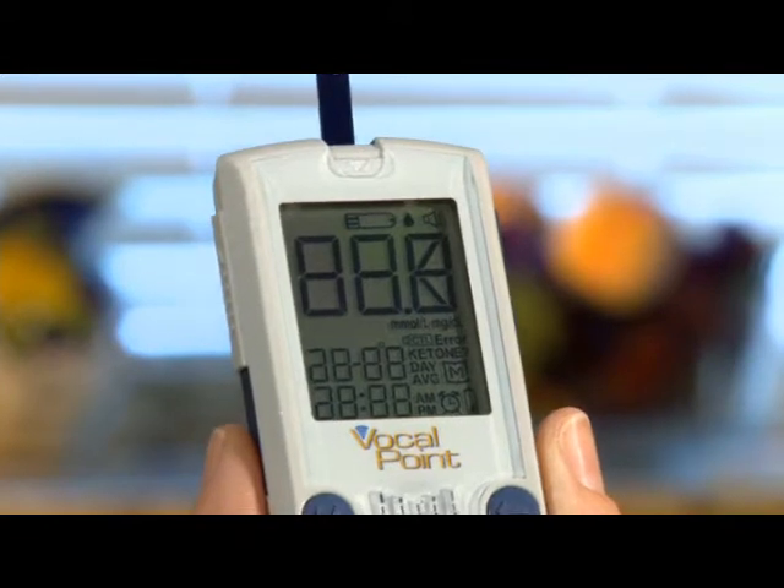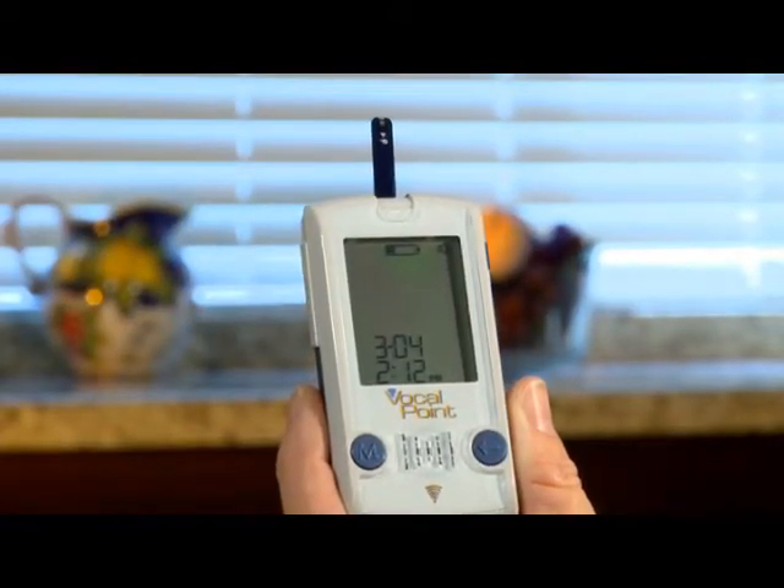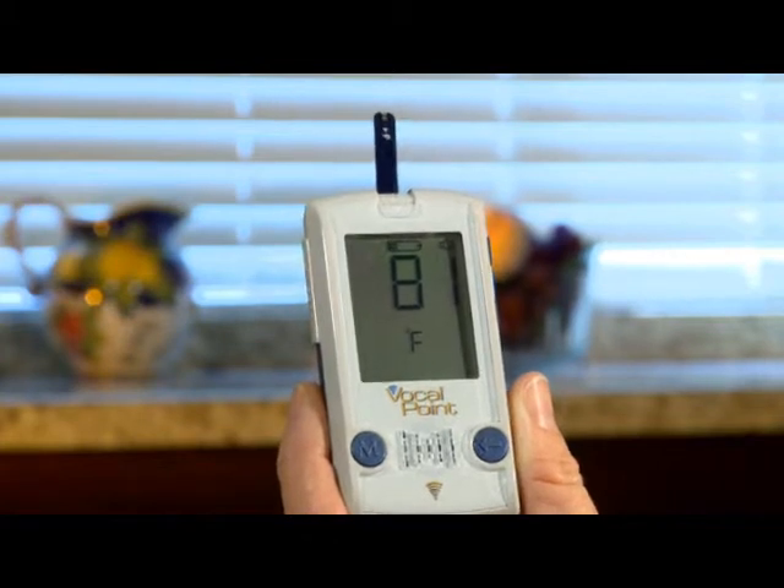The meter will greet you and summarize the meter's date, time, and temperature. Today's date is Thursday, March 4, 2010. The time is 2:12 p.m. The room temperature is 81 degrees Fahrenheit.